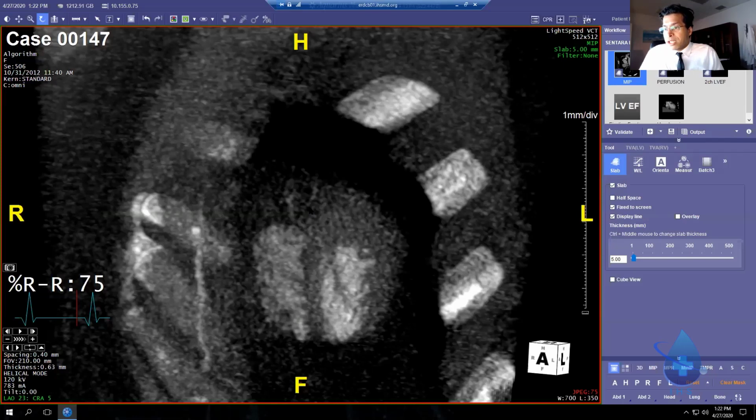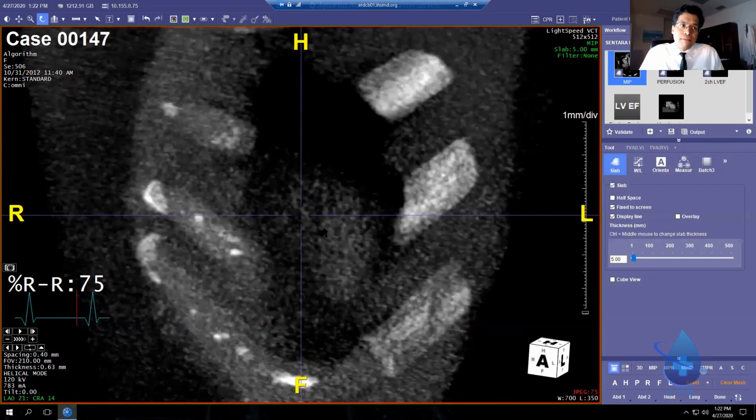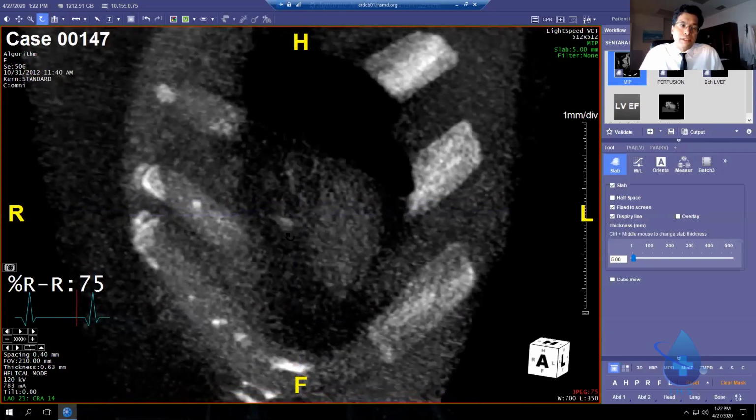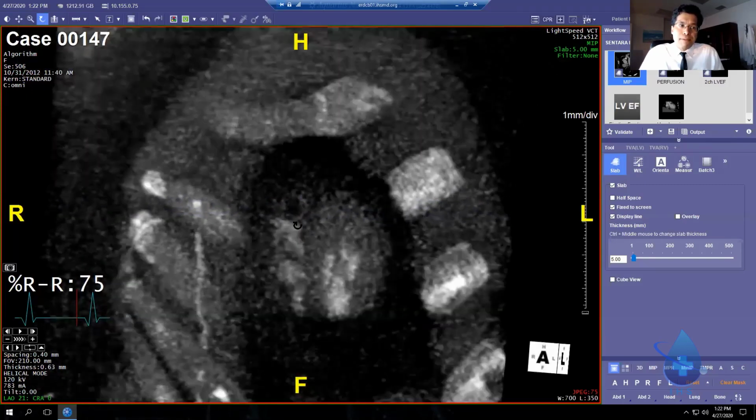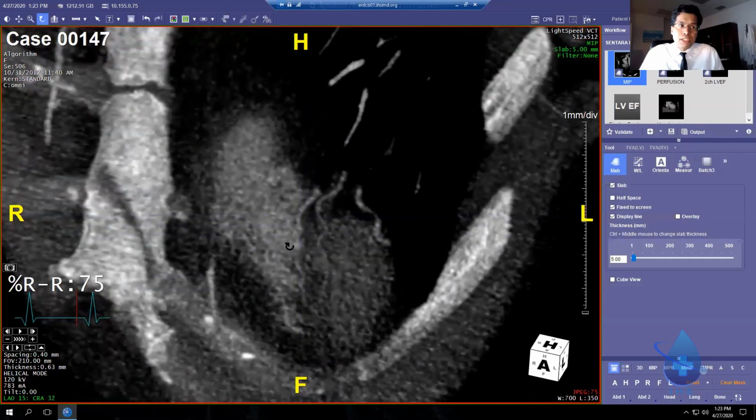All we're doing is injecting a bolus of contrast in the vein, letting it circulate through the right heart, left heart, and hoping it percolates down the coronaries. The only way you can get any contrast down these coronaries is if you give the patient 2 sprays of nitroglycerin before the exam to drop the LVEDP and increase the gradient for driving contrast down the coronaries.